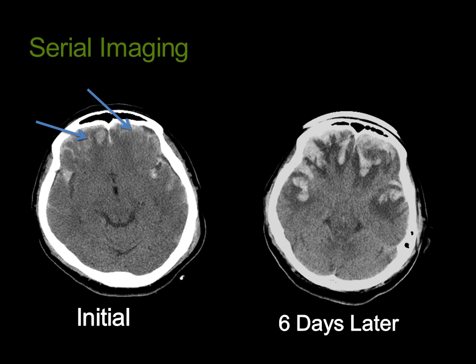Serial imaging assessment is important after head trauma due to the temporal evolution of intracranial injuries. The image on the left is the initial CT scan, showing several small intra-axial contusions bilaterally as well as acute subarachnoid hemorrhage. Six days later, there was dramatic increase in the hemorrhagic component of the bifrontal and bitemporal contusions, with corresponding edema and mass effect, likely with concomitant increase in ICP.